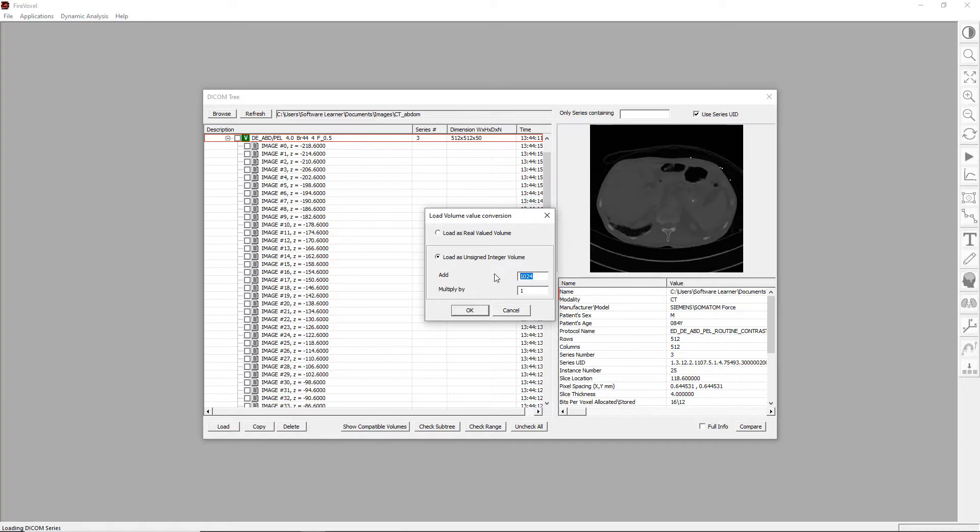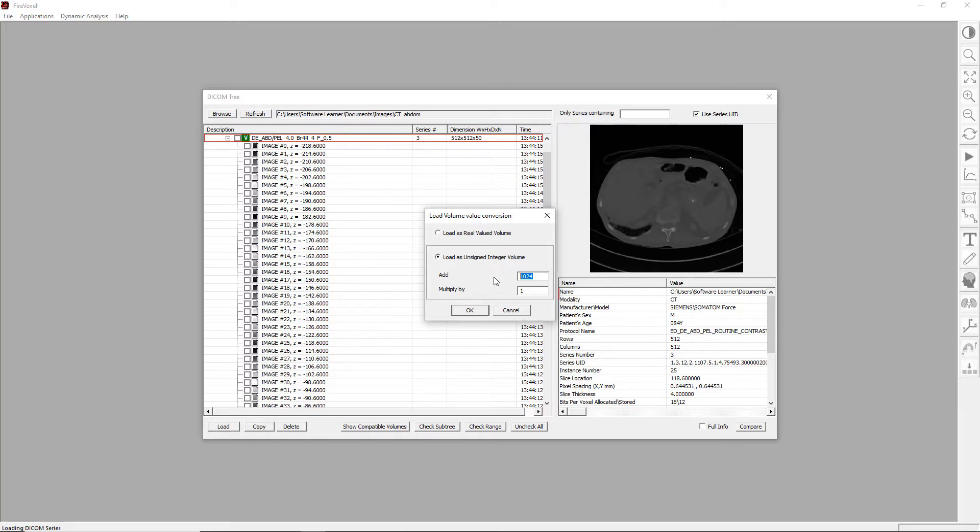With this choice, air, which shows on CT as minus 1024 Hounsfield units, will correspond to zero signal, and water, which is zero Hounsfield units on CT, will show as plus 1024. Let's click OK.